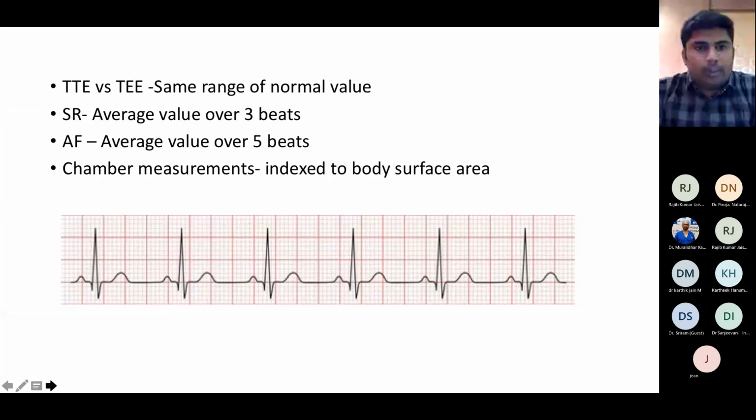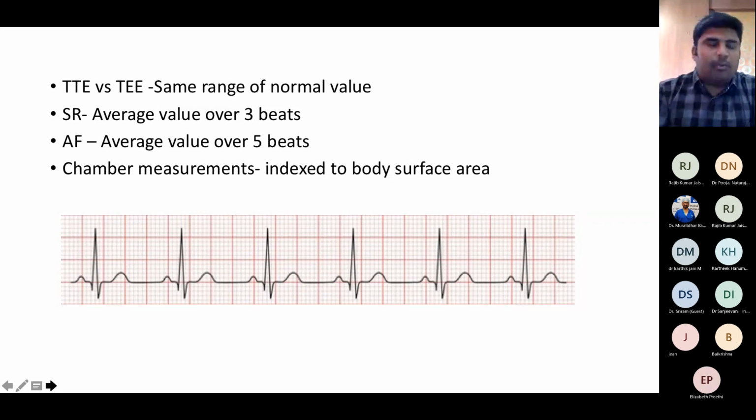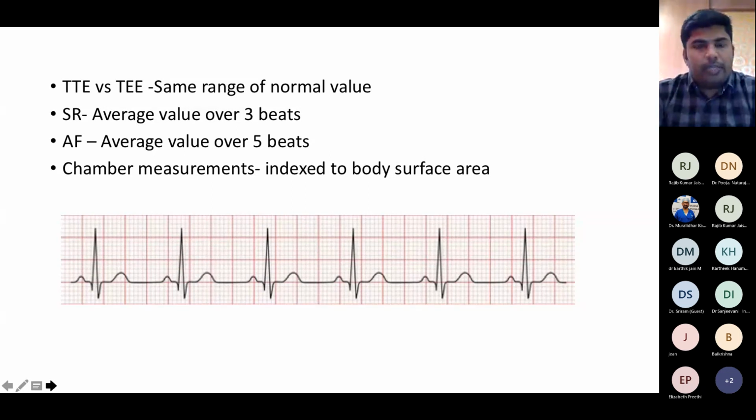the American Society of Echocardiography and the European Association for Cardiovascular Ultrasound came out with recommendations and updates. The last update, in 2015, gives various normal ranges and techniques to measure linear measurements and volumes of cardiac chambers. All these normal values and methods are based on transthoracic echocardiography, and they are adapted to TEE. The same committee also recommends that the normal reference values for transthoracic can be applied to TEE. But unfortunately, not all the standard views measured by transthoracic can be obtained by transesophageal echocardiography, so a few modifications are available, which I will mention in the further session.